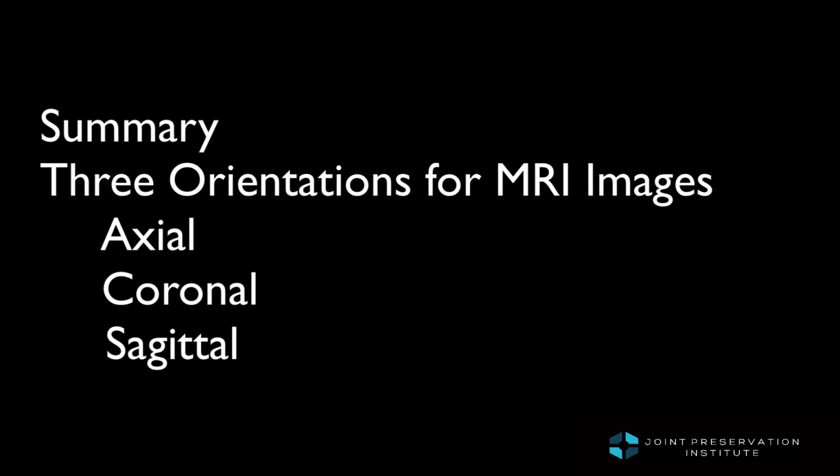In summary, we have discussed the three orientations for MRI images, which are axial, coronal, and sagittal.